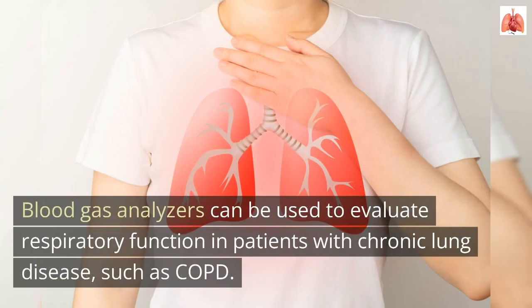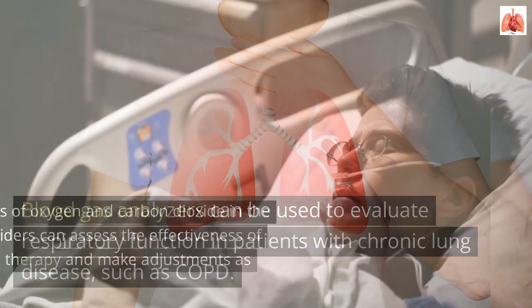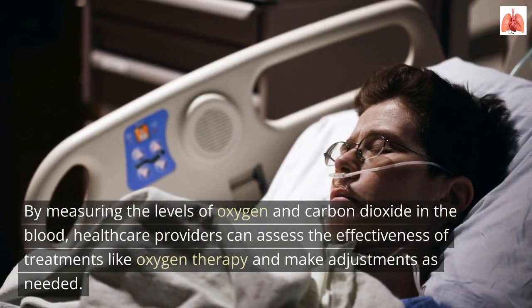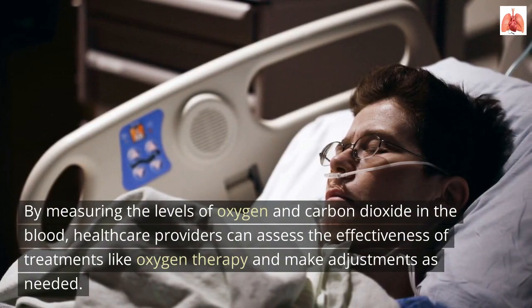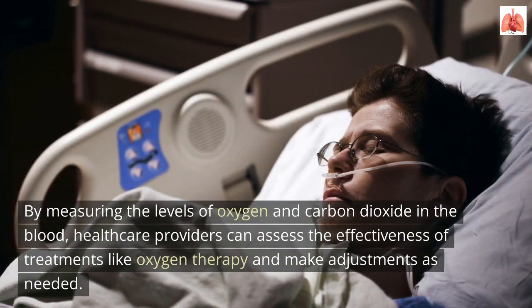Blood gas analyzers can be used to evaluate respiratory function in patients with chronic lung disease, such as COPD. By measuring the levels of oxygen and carbon dioxide in the blood, healthcare providers can assess the effectiveness of treatments like oxygen therapy and make adjustments as needed.